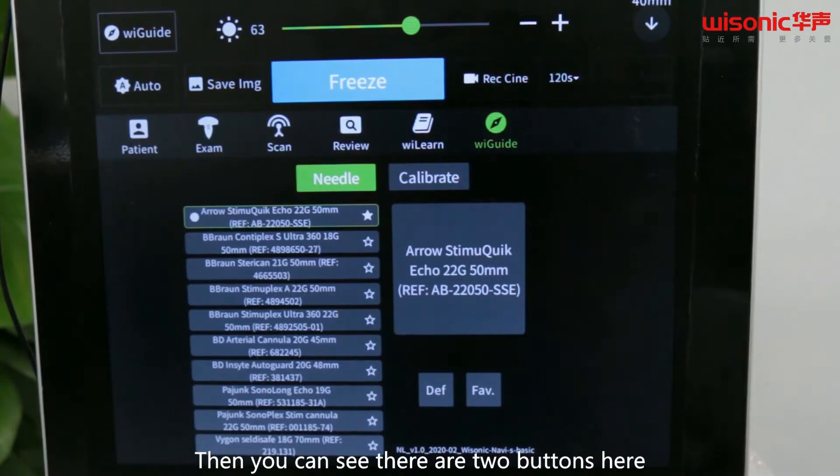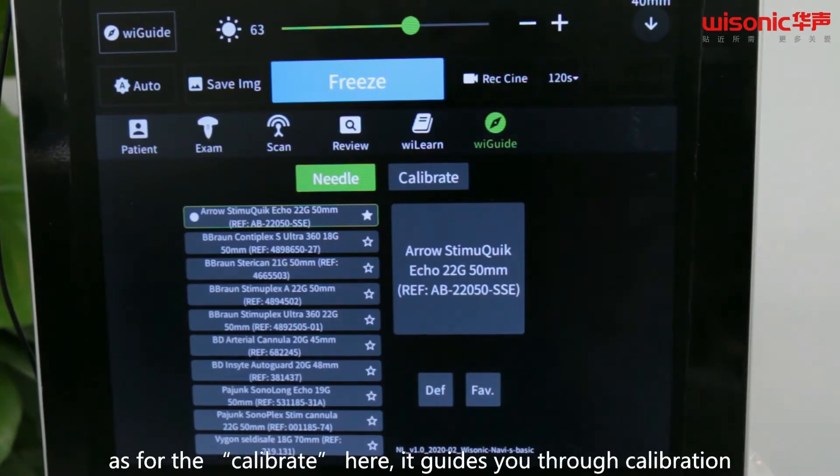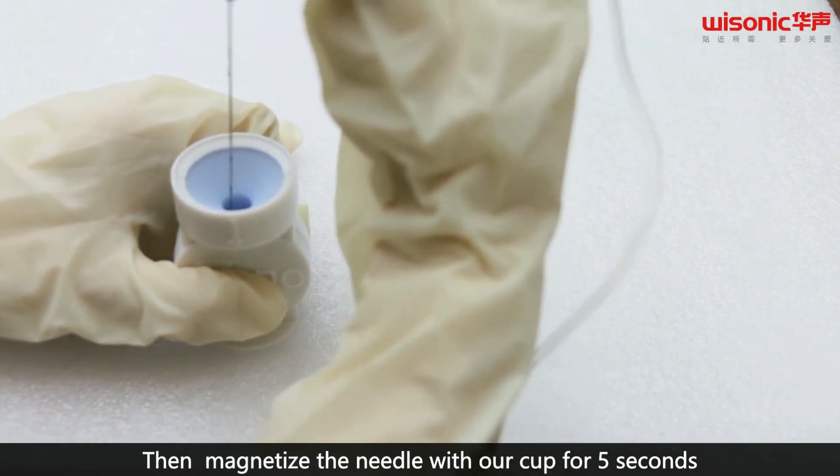You can see there are two buttons here. Needle allows you to choose the model and the size of the needle body. Calibrate guides you through calibration. Then magnetize the needle with our cup for 5 seconds.